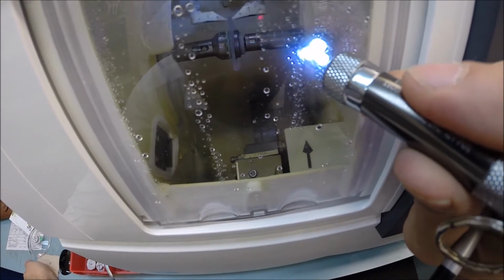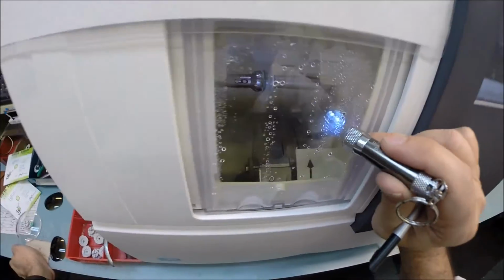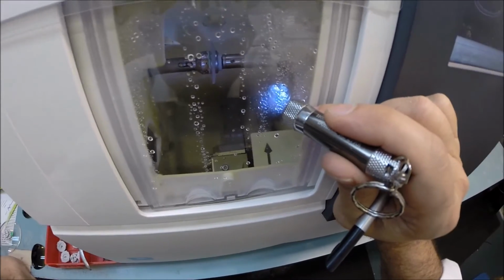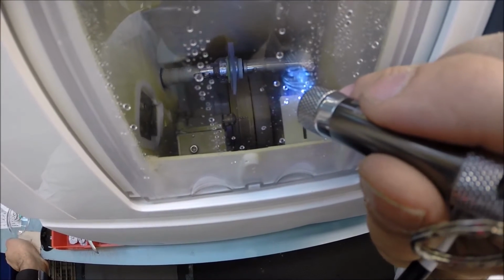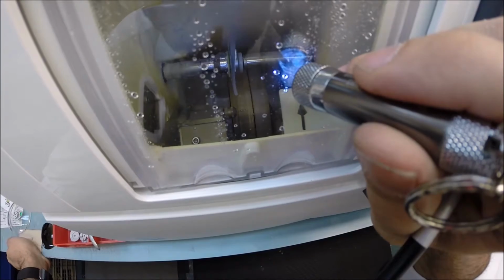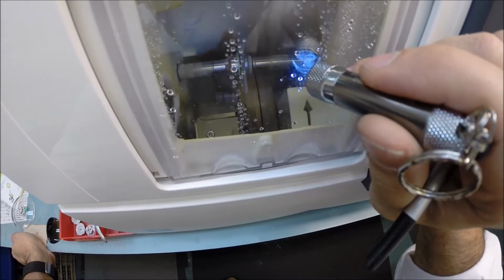Now it's actually tracing one last time to know exactly again and precisely where to place the bevel so it fits best in the frame. After the cutting cycle, it's just triple checking all measurements. That's what $40,000 will buy you. So if you also notice your lens is completely flat like a nickel, if I were to take it out now, it could stand up on the counter on its own. Now it's getting the V-shaped bevel and the knife-like bevel, so it'll fit inside the bevel of the frame.